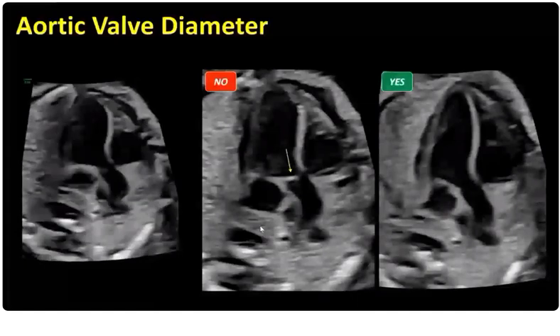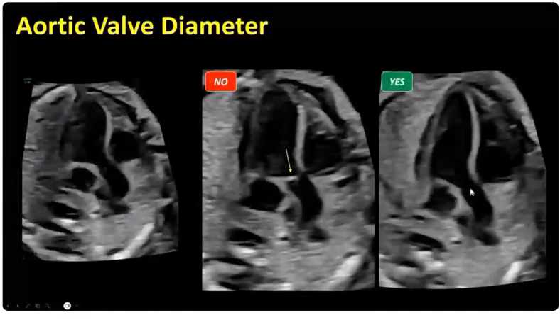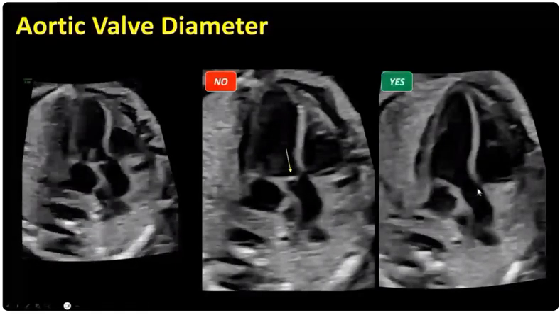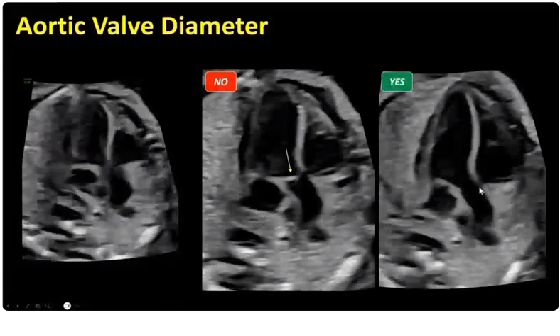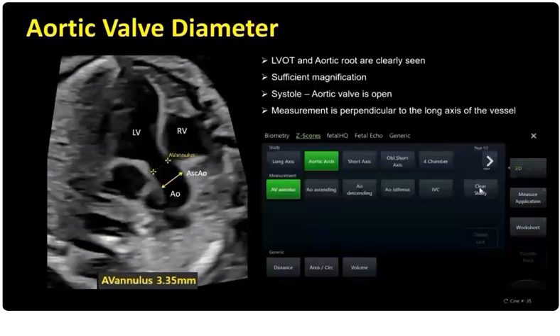So for the aortic valve diameter, again, we are looking at the LVOT view, and here we need to make sure that the valve is completely open. The normal valve will demonstrate no leaflets in systole, so they will not be visible. This is exactly where we're supposed to apply the measurement. Here we need to get the LVOT with sufficient magnification and clear visualization of the aortic root. We need to find the frame that shows the aortic valve completely open. It's in systole, and the measurement should be perpendicular to the long axis of the vessel.